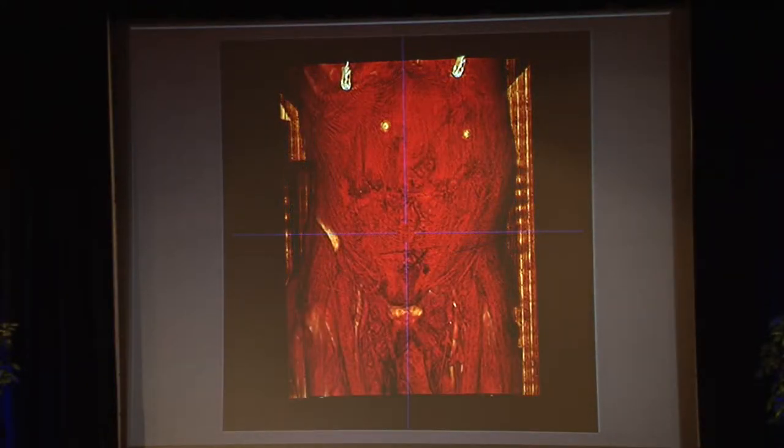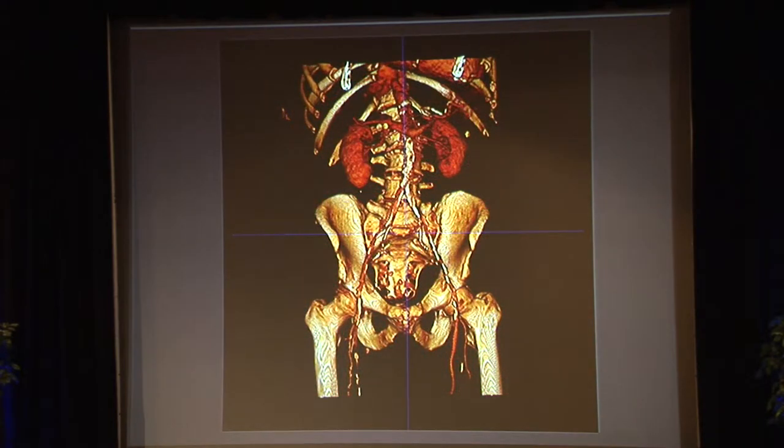It's going to cut down to the vascular and the bones, and then I'm going to remove the bones from the picture. So we see the aortic tree and the arteries below it. The white is all calcium in the picture. I'm going to make the picture rotate a little bit so you can see it. I'm actually going to do it twice, so you can see how much calcium there is in this patient.